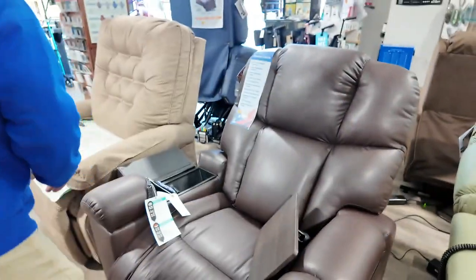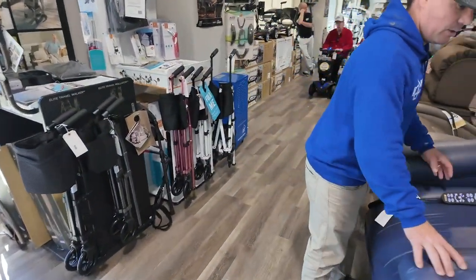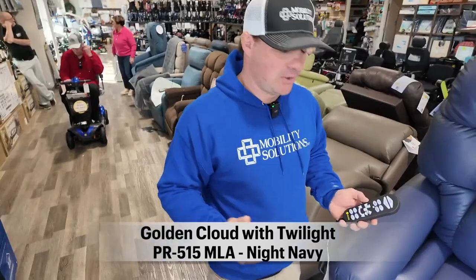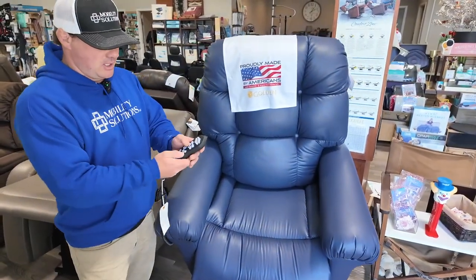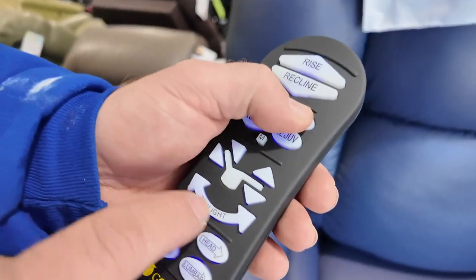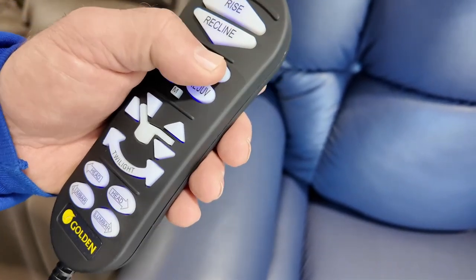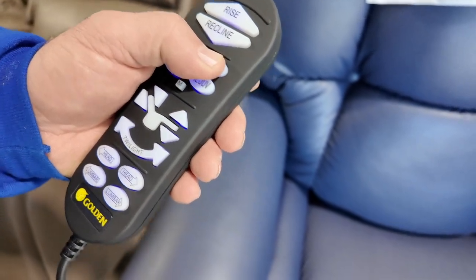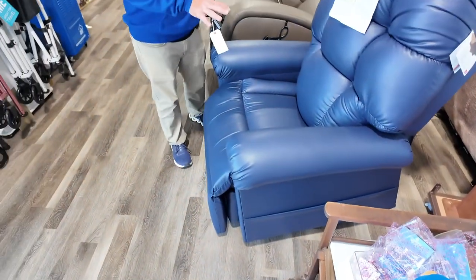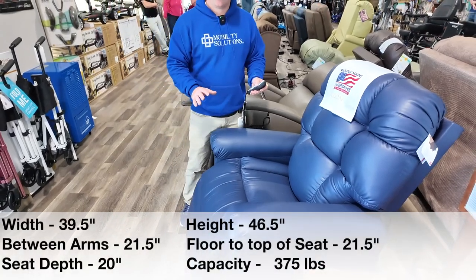Let me show you the PR515 in Knight Navy Brisa. This chair is probably one of our most sold chairs because it can put your feet above your heart. We consider this Comfort Zone 5 — the Twilight feature gives you that extra motor, and Comfort Zones go by motor count, so Comfort Zone 5 means five motors. You can also get this chair without Power Pillow, without Lumbar, and without the Twilight.